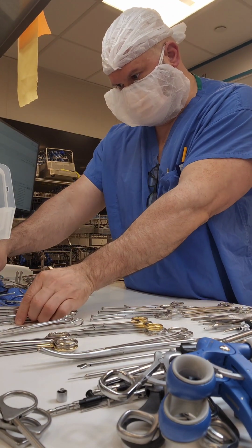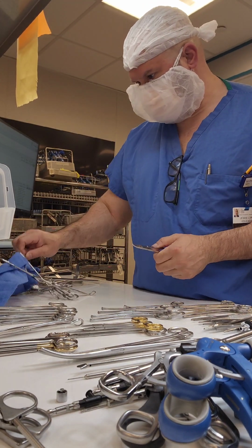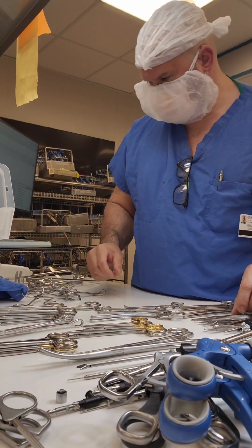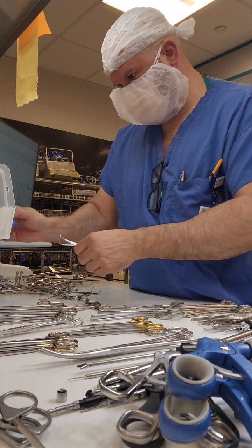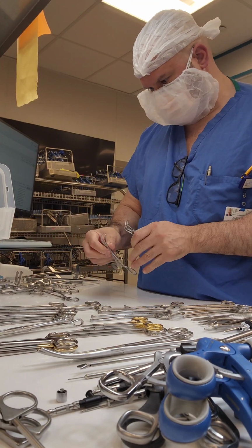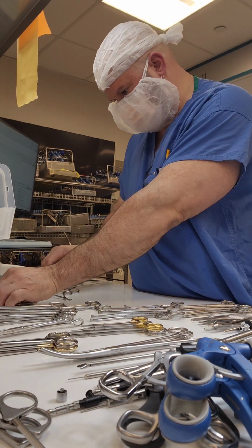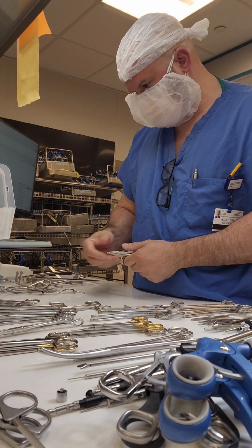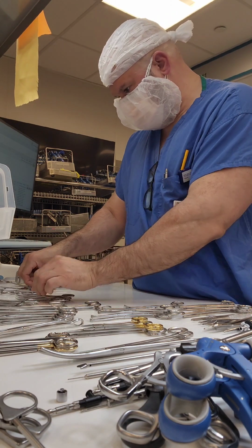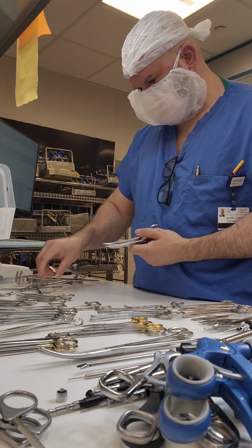Now, if you've noticed, guys, I have not scanned my basket yet. We use a tracking system. I do not scan my basket until I've sorted my instruments out. Why do I do that? It can be contradictive if you're being tracked by production and it shows some gaps in your productivity. But I don't do it because what if I find a dirty instrument here, right? Now I have to go ahead and take that instrument basket back to decon. I got to cancel my load. I have to scan my load back to decon.